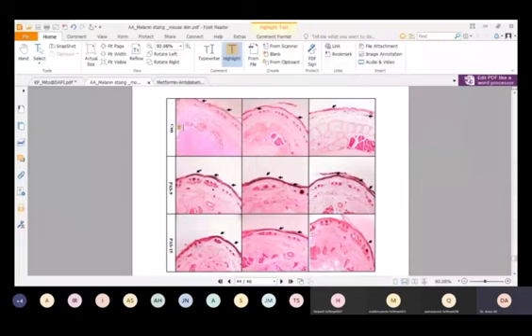Okay, this is the stained tail section of a control mouse and a plasma treated mouse. This UN means the control sample, which is not treated with plasma. And here PAS 9 means plasma activated solution treated with 9-minute plasma. And this PAS is the 15-minute plasma treated solution.